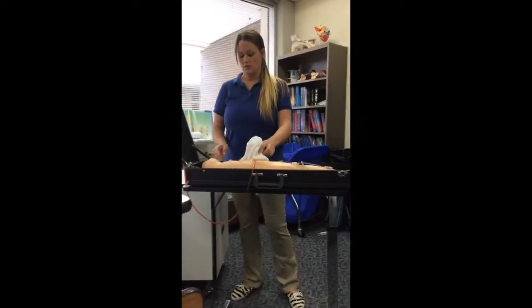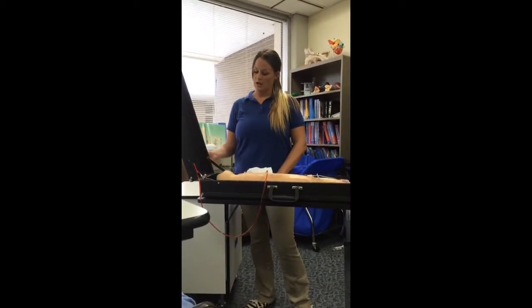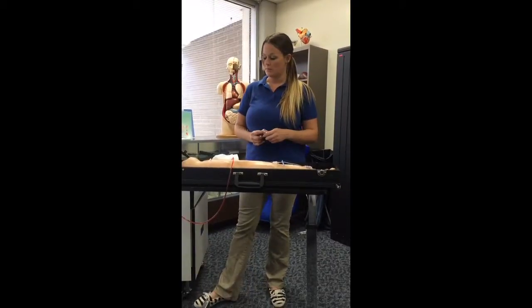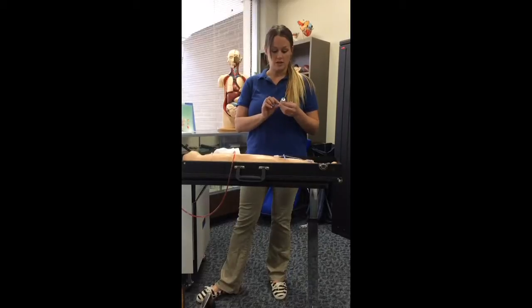First, I'm going to look at my MAR. I see that the doctor has ordered vancomycin 250 milligrams IV every 24 hours. The pharmacy has given me a vial of 500 milligrams per 5 ml, so I'm going to draw up 2.5 ml. First, I'm going to check the expiration date.